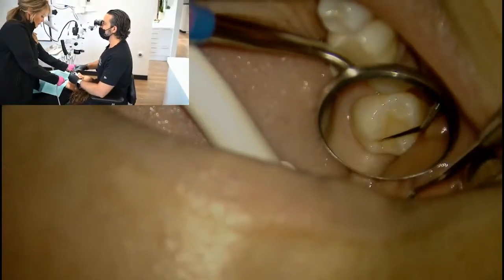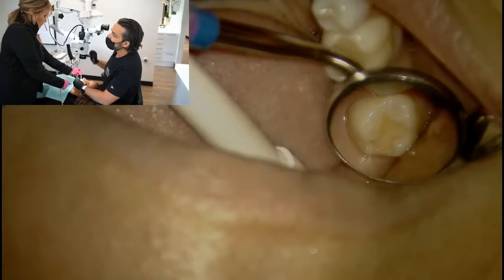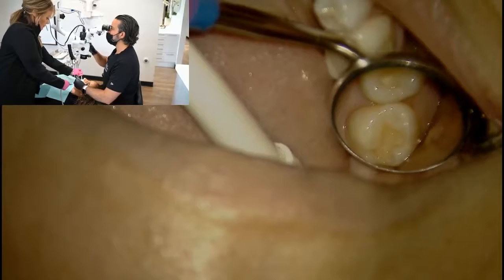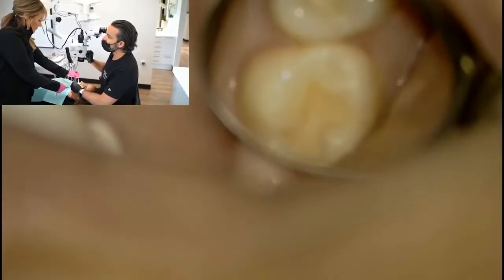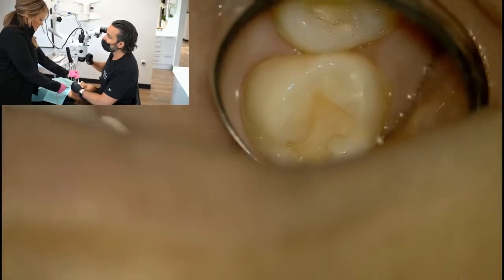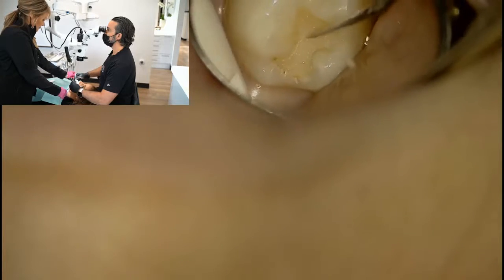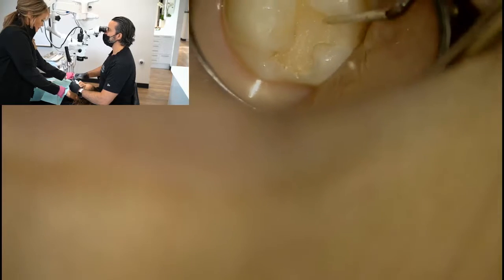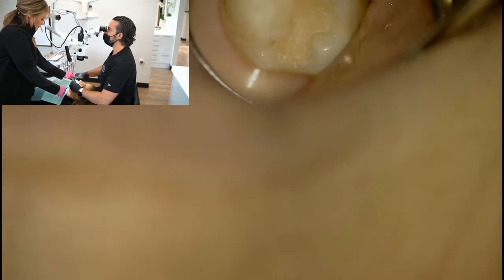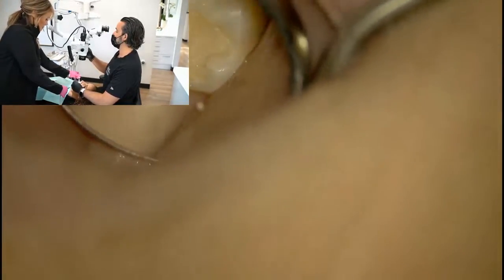And it can proceed to kind of inspect the quality of this restoration. There we go. So we can magnify this up a bit. And take a look at some fun defects here. One of the nice things too is letting your staff and your patients sometimes see what you see. It's kind of really nice to explain things.